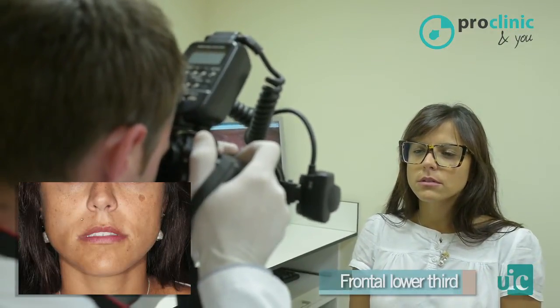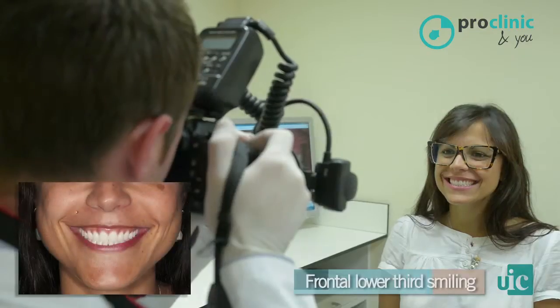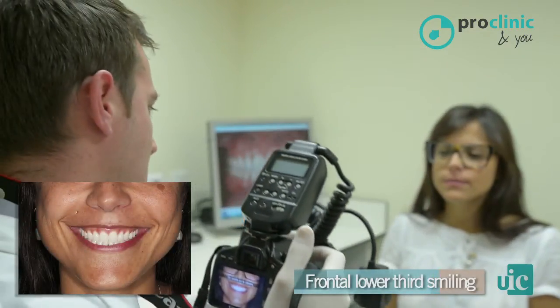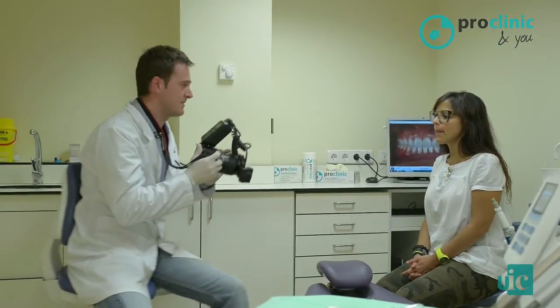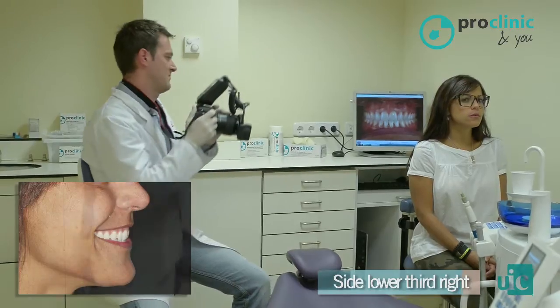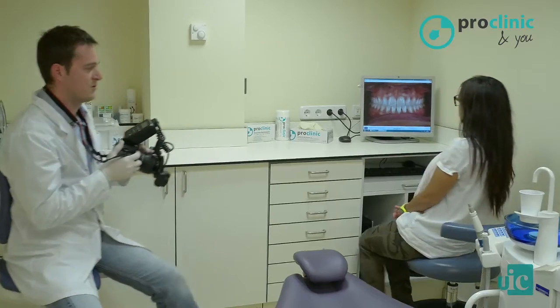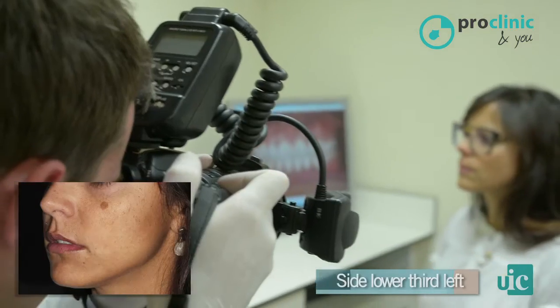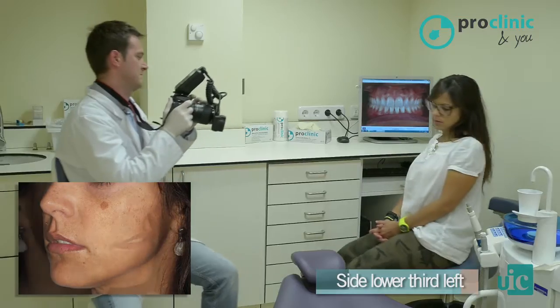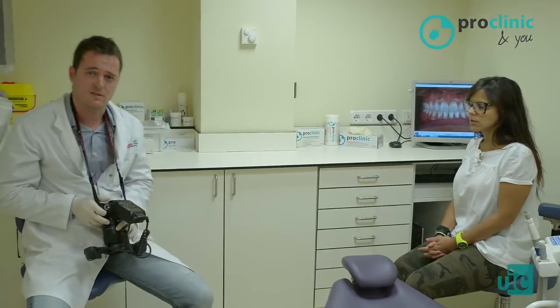Photo of the frontal position of the face. Frontal photograph of the patient smiling. Photos from both sides, right and left. We ask the patient to turn 90 degrees, first to the left to take the right side picture, and then rotate to the right. Oblique photos, right and left. We take two oblique photographs, asking the patient only to turn 45 degrees.